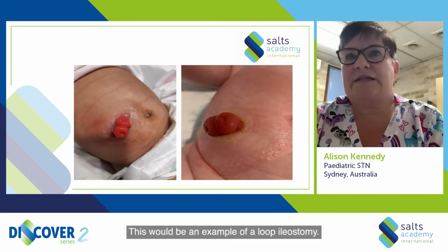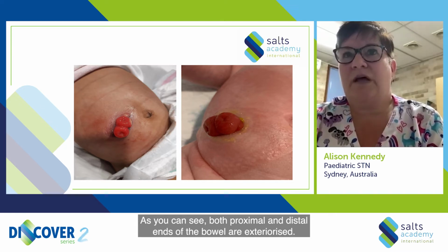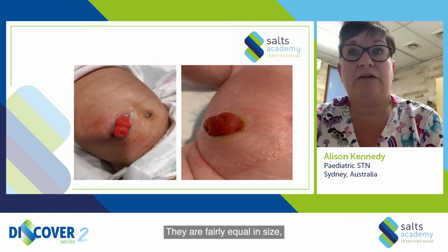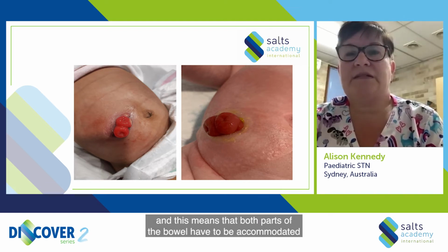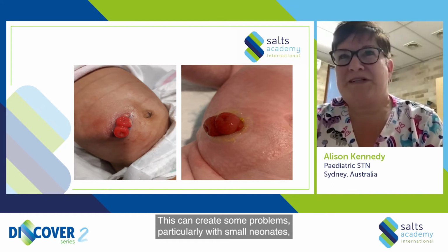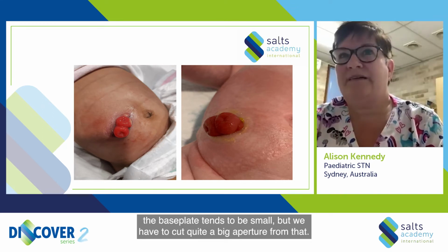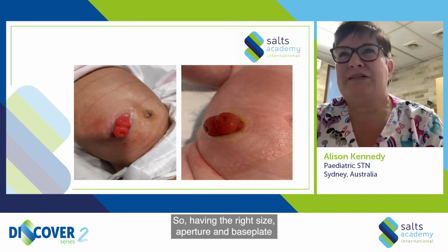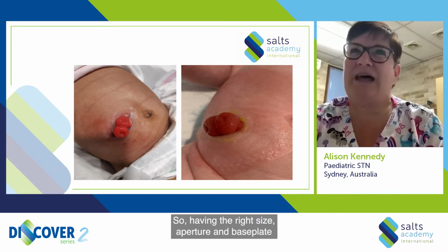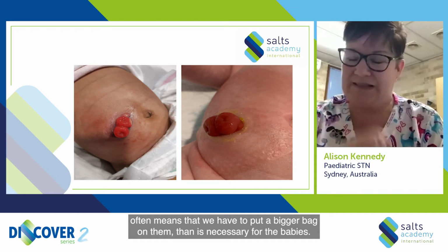This would be an example of a loop ileostomy. As you can see, both proximal and distal ends of the bowel are exteriorized. They are fairly equal in size, and this means that both parts of the bowel have to be accommodated within the aperture of the stoma bag. This can create some problems, particularly with small neonates, because the bags are designed to be quite small, and the base plate tends to be small, but we have to cut quite a big aperture from that. So having the right size aperture and base plate often means that we have to put a bigger bag on than is necessary for the babies.